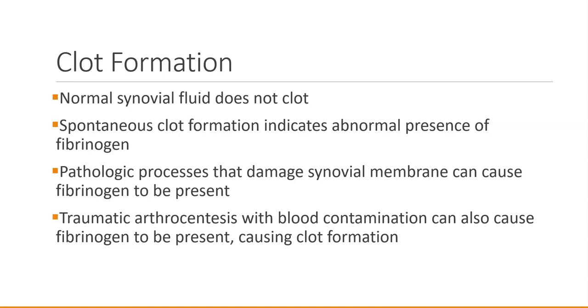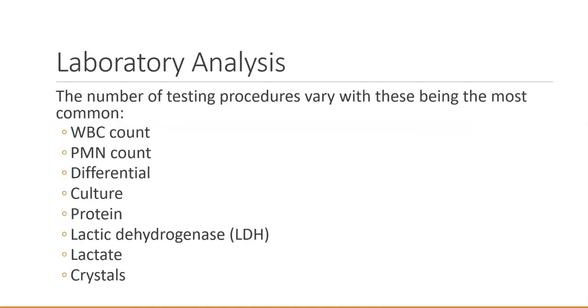In the laboratory analysis of synovial fluid, there's a number of testing procedures that can be done, and these will vary. Not all of these will be ordered, and perhaps additional tests will be ordered. The most common tests are the white cell count, polymorphonuclear cell count, a differential, a culture, measuring the amount of protein, lactate dehydrogenase (LDH), lactate, and crystals.